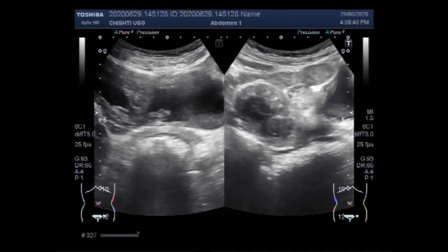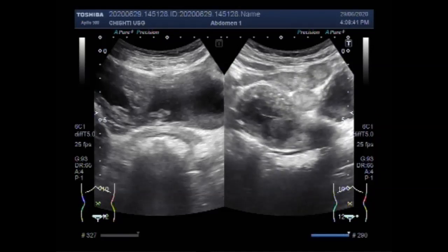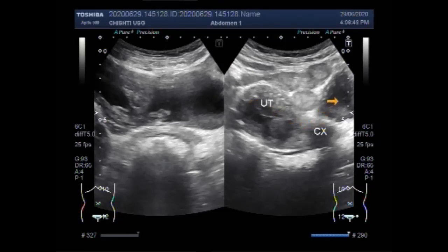A bladder ultrasound can show how much urine the bladder holds when it is full and whether someone is completely emptying the bladder when urinating. Bladder ultrasound is often done along with an ultrasound of the kidneys.